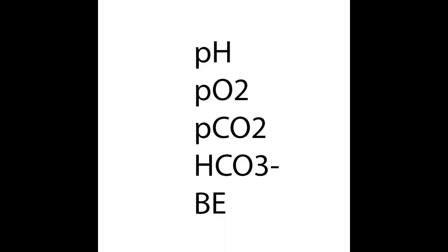The reason the other results are there is that someone in the past probably thought it would be helpful that if you are testing a blood sample, you could add glucose and electrolytes and run it through a co-oximeter. So you get a lot of helpful information, but these aren't blood gas results.